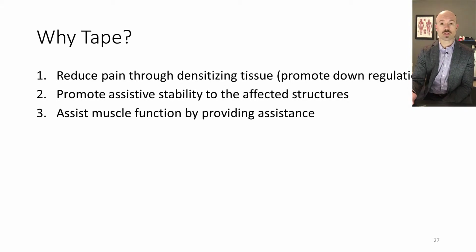If we have a patient who's reporting having pulled something in their back as they're shoveling snow, per se, then we could use biomechanical tape to offload and deload those structures. So again, in those situations, we could use tape to our benefit.